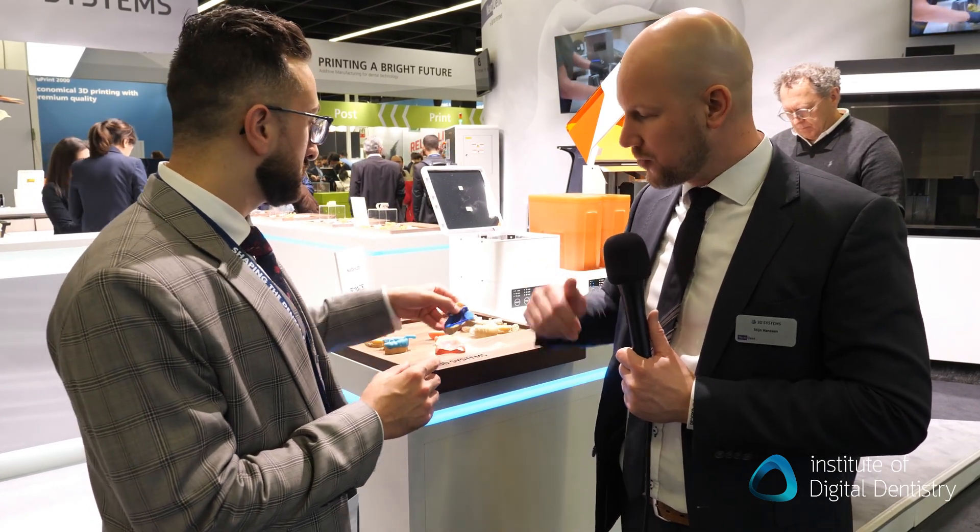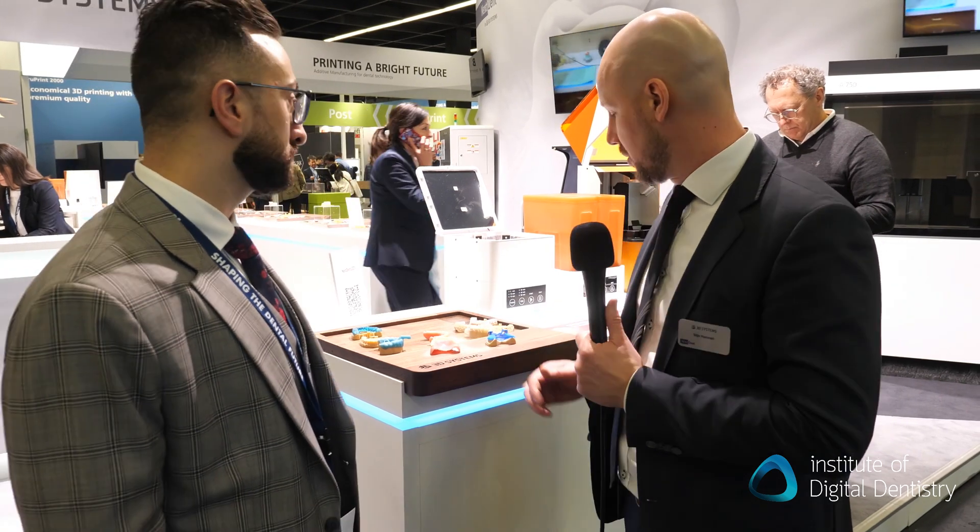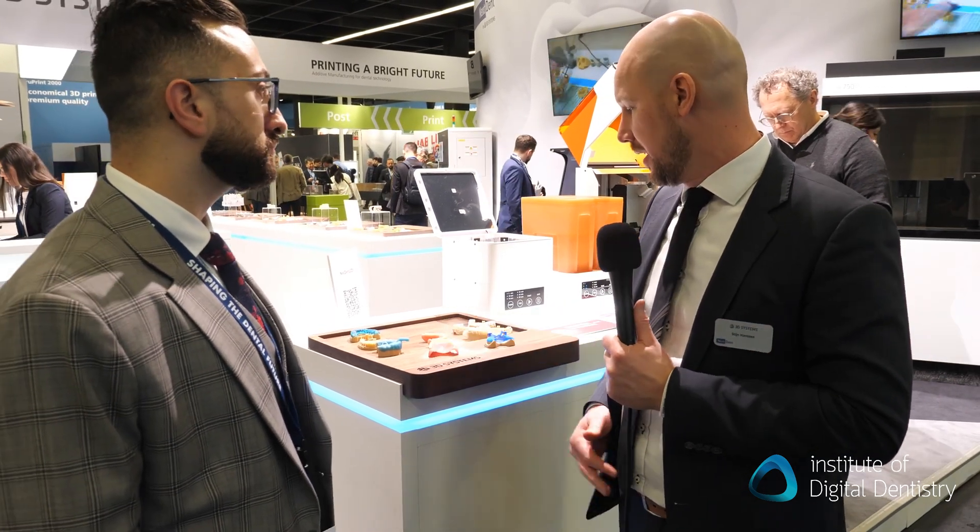It's much less of a tricky thing to work with in the laboratory workflow. So these are the two new materials — the new base and Cast Blue. And of course we are always working on new materials, so look out for us.